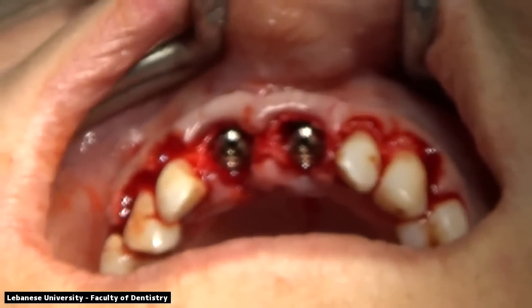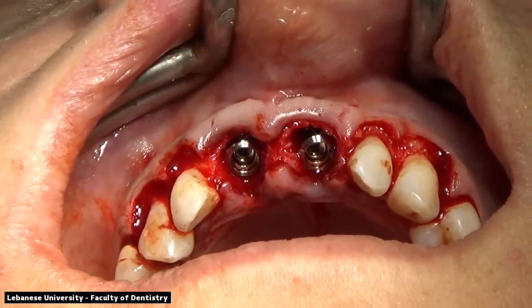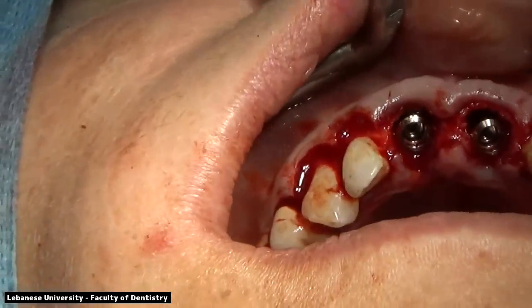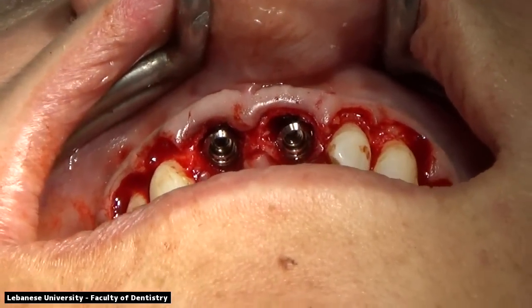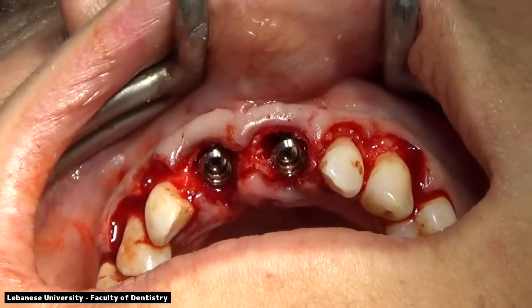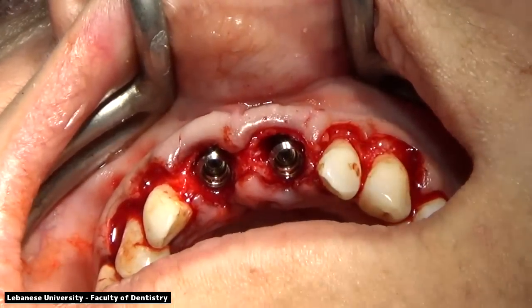So we will be attaching the abutments right now to the implants. So we're connecting the abutments to the implants. The abutments that we're placing are 5.5 millimeters in diameter. They're direct post abutments.